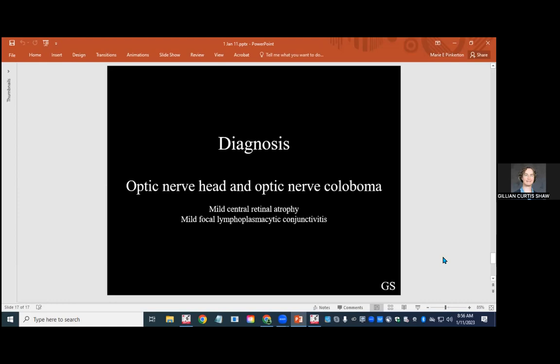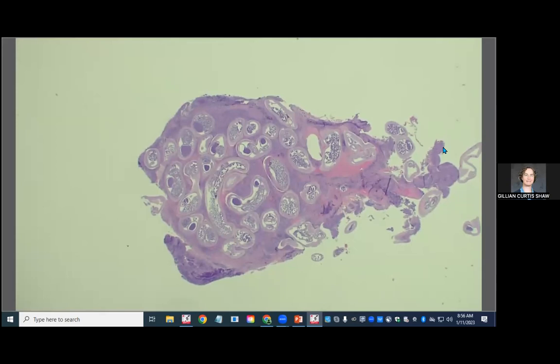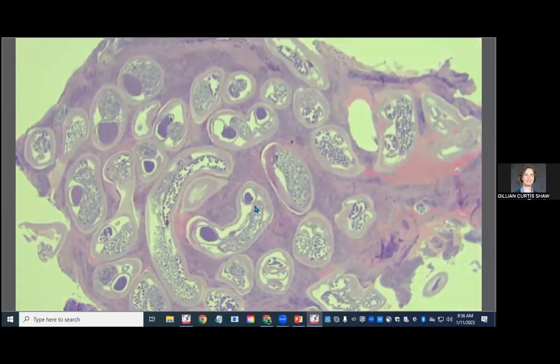I don't have a gross photo because we got little bits of tissue, which we never take pictures of because they're boring, grossly. So I'm just going to jump right into the histo. Just imagine a tiny pink nub of tissue. At this relatively low magnification, I hope you can appreciate that there's lots of fun things happening in this tissue. Basically, we have a collagenous connective tissue that has embedded numerous organisms. These organisms are linear. So we're catching them in longitudinal section occasionally, but mostly in cross section.